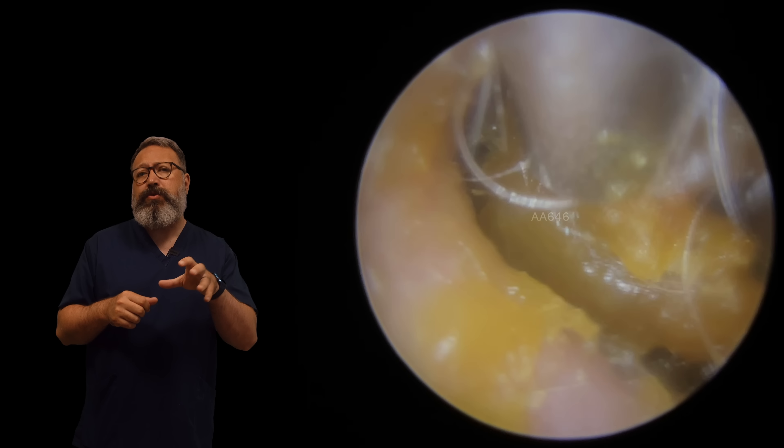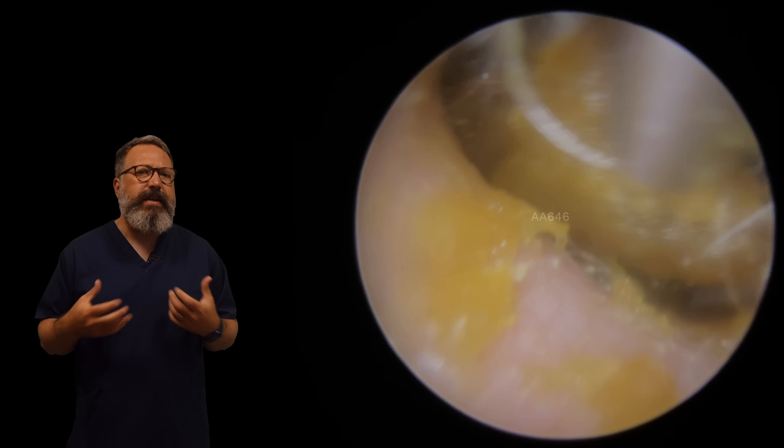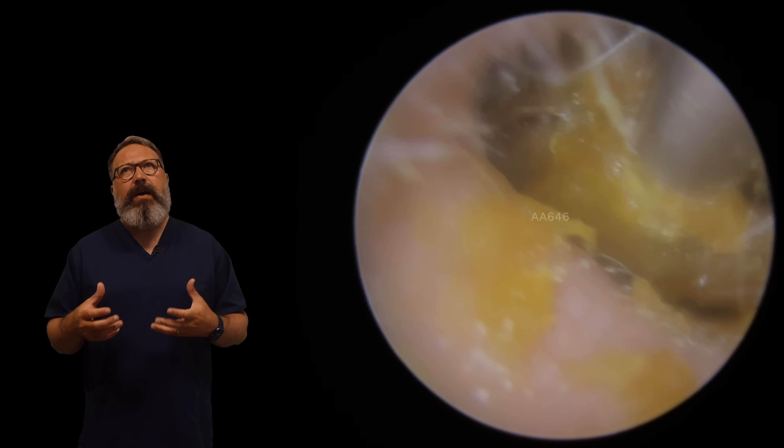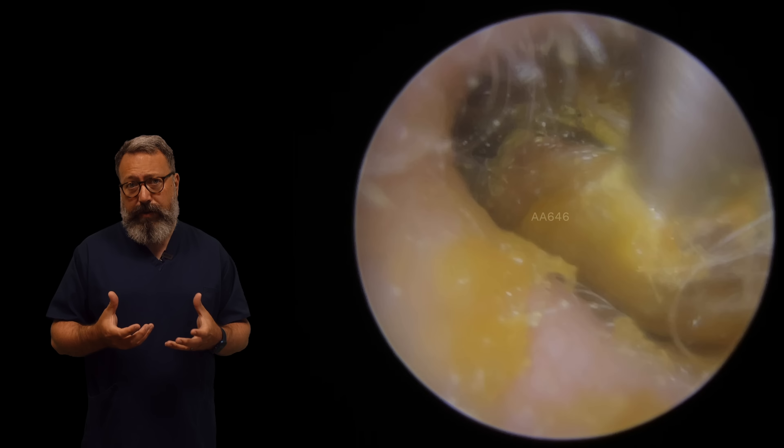I know a couple of people in the comments section always ask me, why don't you tidy up the outer part first? Surely it's got to make it easier when you're going past. If the wax was very sticky like this one is and you've got some very sticky wax on the outer part of the ear canal, it's worth tidying up that outer bit first.